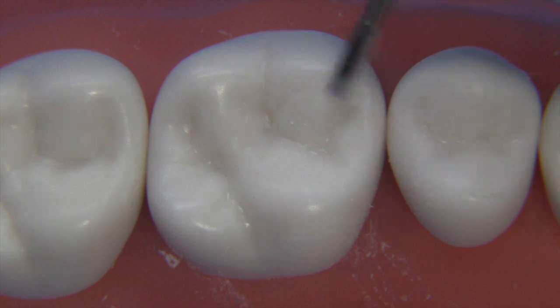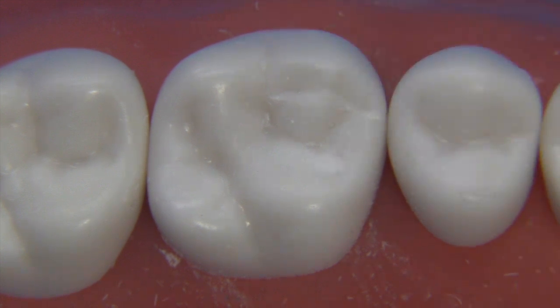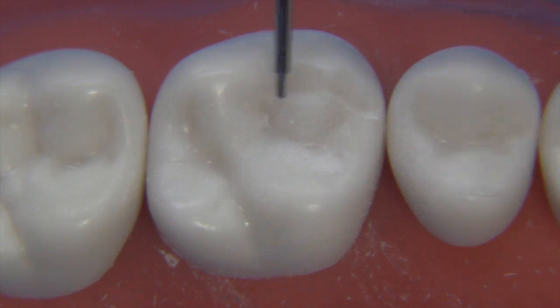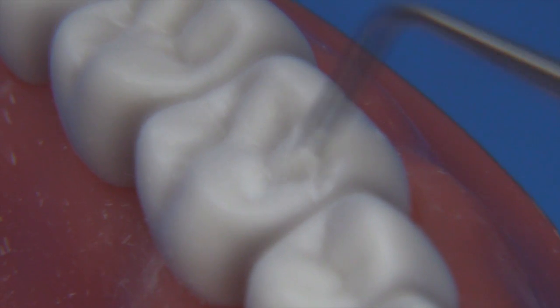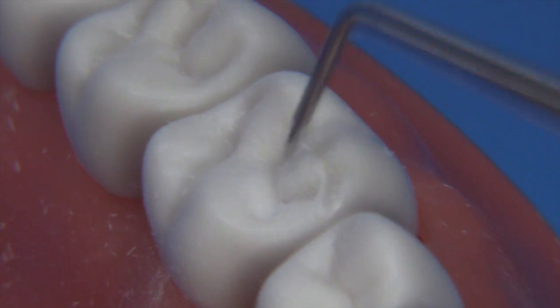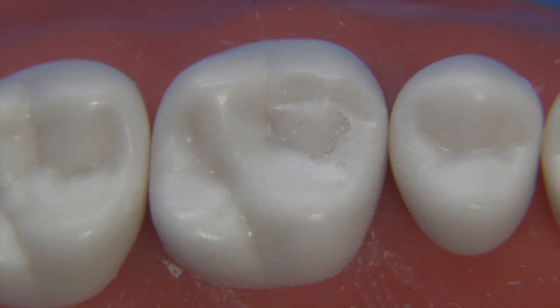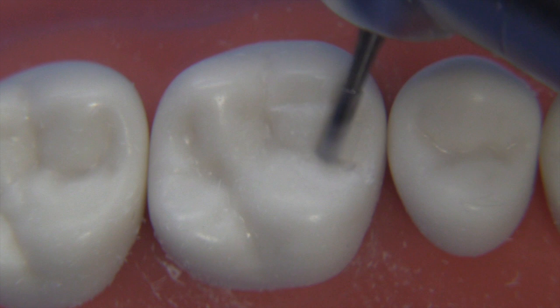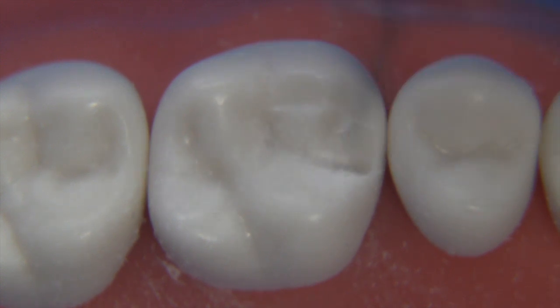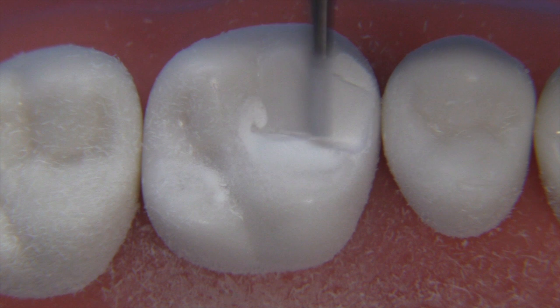Let's get started. I'm going to make a little 0.5mm reduction to remove just a little bit off the cusp tip, but from here we're going to be progressively increasing the depth toward the central groove area where it will be 1.5mm. You can measure that area — it's just about 0.5mm in depth so far. This is not the offset; this is just the initial reduction off the cusp tip. Let's continue with the 57 burr — you could use a diamond, but I like the 57 burr for gold preps as it cuts very nicely and can be very sharp and well-defined internally. We're going to use this burr to complete the occlusal preparation.